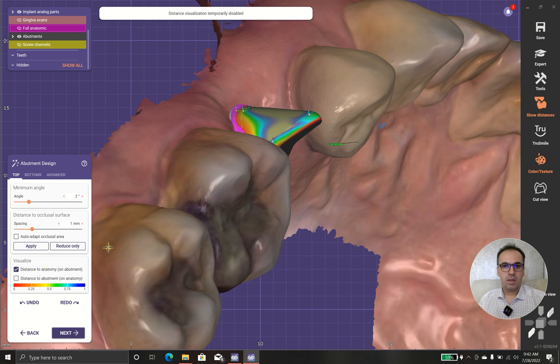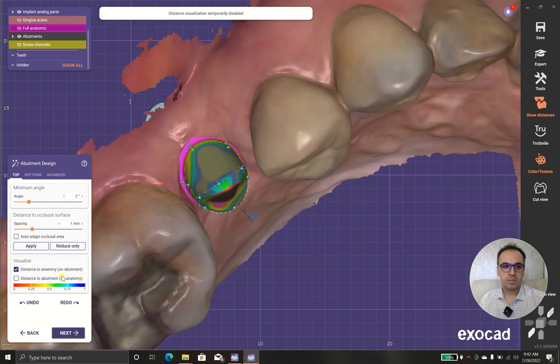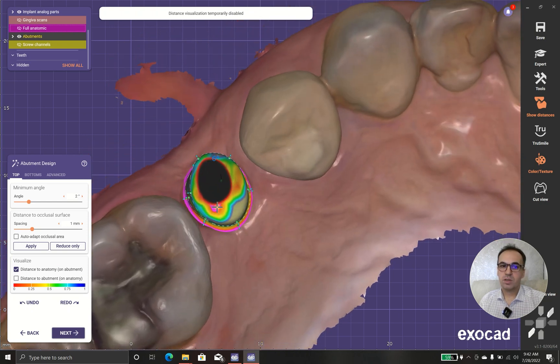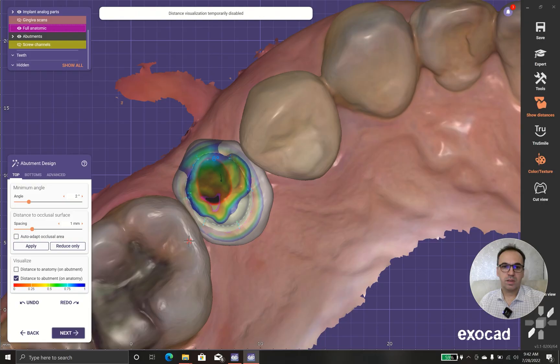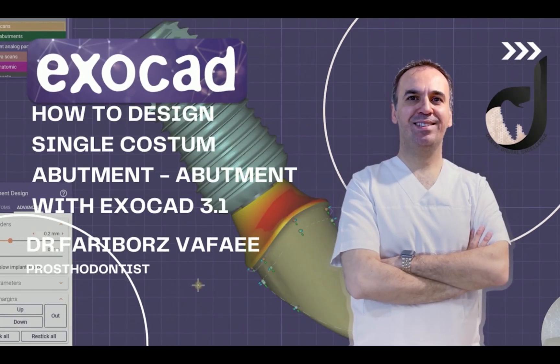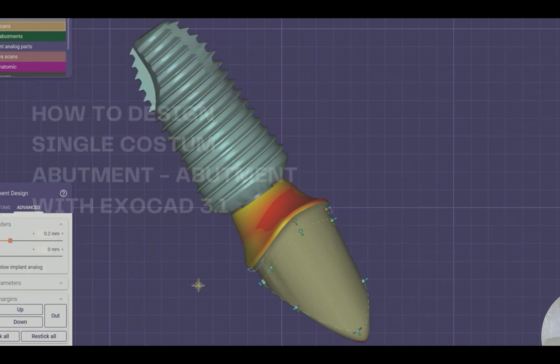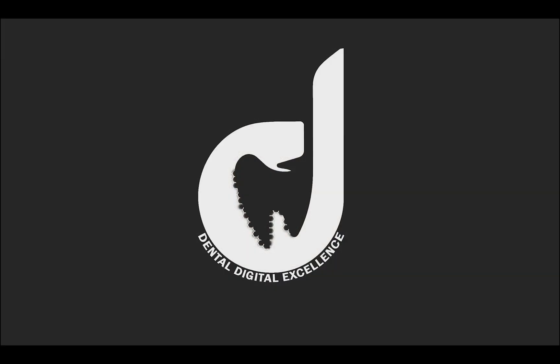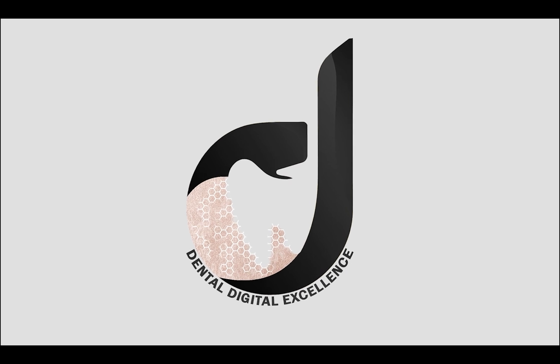It shows our design is having enough space to the crown, but it also shows there is a shortage of space in one area. Let's review the final design.